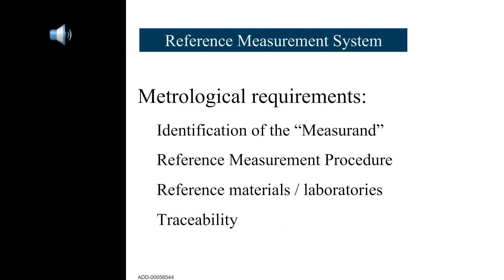But modern day practice of clinical biochemistry requires methods to be standardized to a metrological standard. And the requirements for metrological standardization are identification of the measurand, the production of a reference measurement procedure, reference material, primary reference material, and laboratories that can use this method to actually standardize laboratory methods. And also results should be traceable back from the patient sample to the reference measurement procedure.